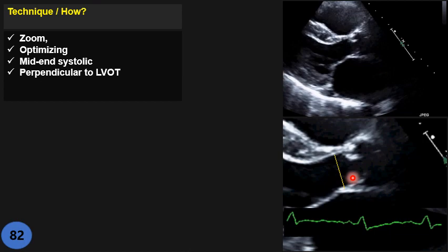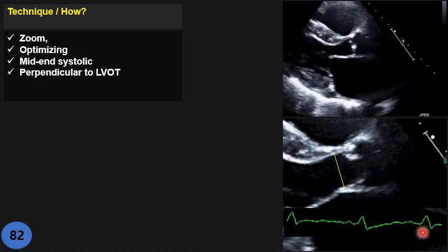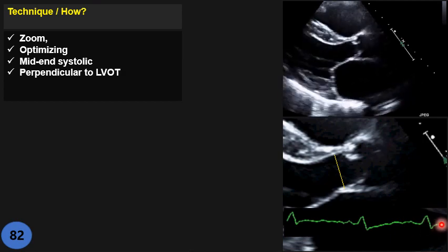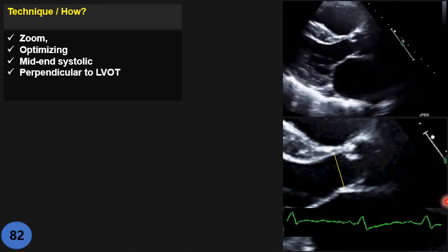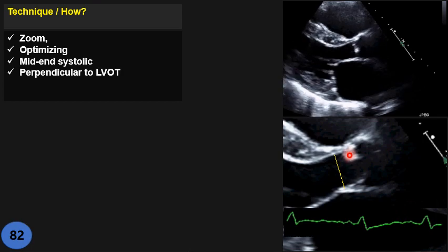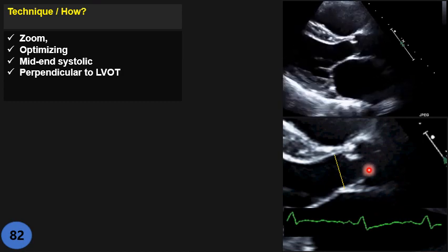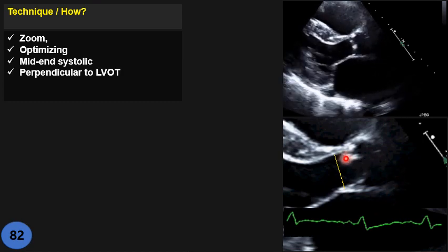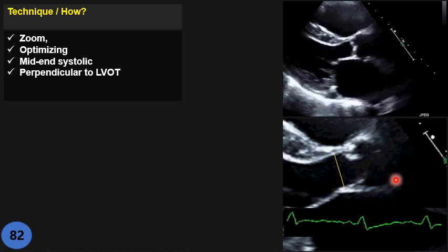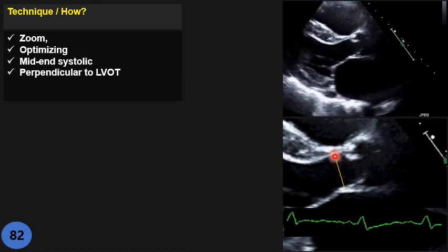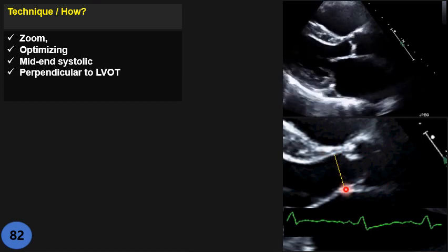When you have a clear image with sharp borders — optimized with gain, wall filter, and everything — go to mid-systolic or end-systolic time of the cardiac cycle. This usually corresponds to the ST segment, or almost the peak of the T wave. Whichever gives you the largest diameter — whether mid or peak systolic — go by eyeball to find the spot with the best and largest diameter, then measure the line perpendicular to the vessel wall.